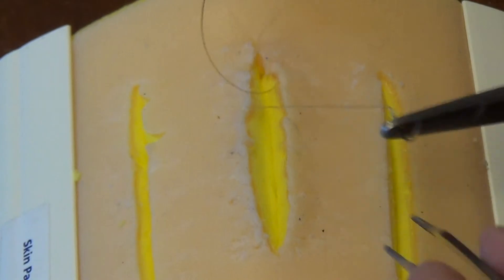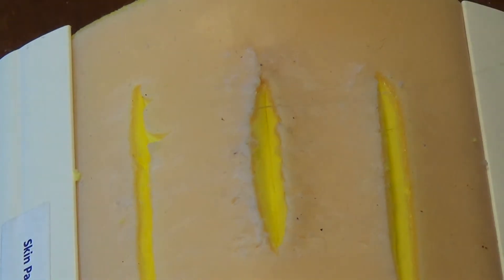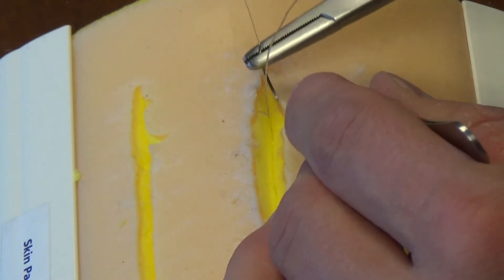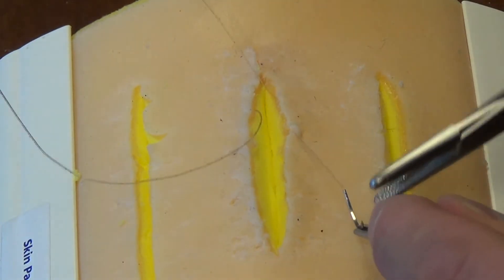You can see these throws are more horizontally based than deep vertical, as we've shown in some of the other demonstrations. Just right beneath that layer of the skin.